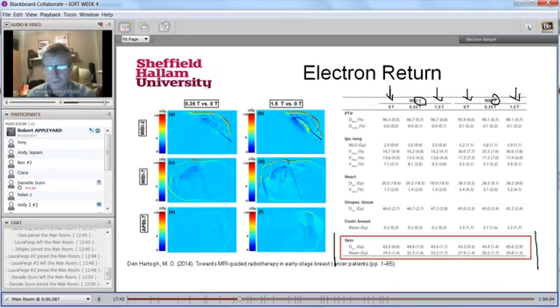So it looks quite small, but it's very significant. It's certainly statistically significant, this increase, and it may be of concern in how we plan and have to care for certain patients. So you can see on the colour wash of these patients. So we've got, if we look at, there's 2 options here. So we've got MRI guided radiotherapy.